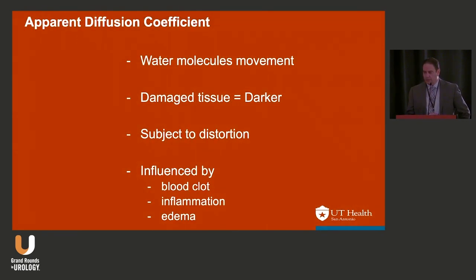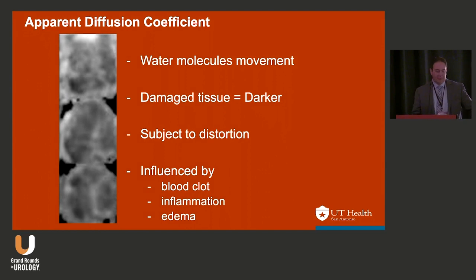So when I look at apparent diffusion coefficient, other than our radiology colleagues who were up here doing an amazing job, what Ralph Klayman would say is, this is a snowstorm over Iowa. Basically, it's really difficult. There are different globs here. I don't know what's what. When I'm in the clinic trying to show a patient something, it's very difficult to say, oh yeah, that's it. Some of us that read them a lot can do it, but just pulling this up in front of a patient, you have to have a lot of confidence to do that.